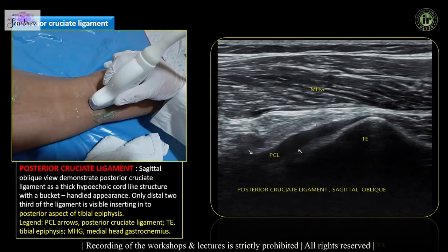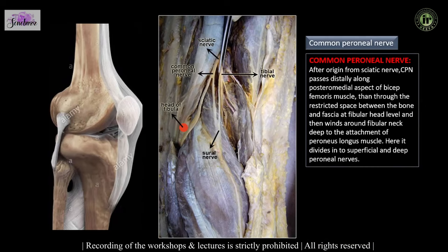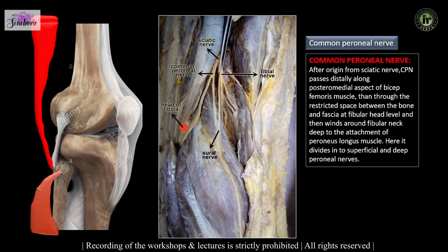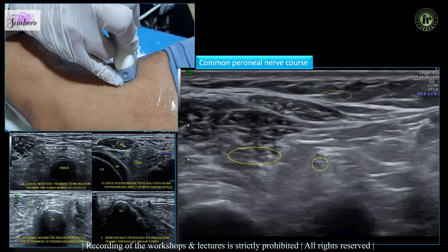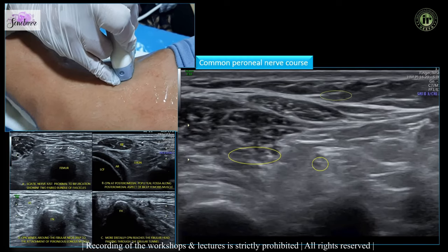Keeping the caudal aspect of the probe over the tibial epiphysis, we rotate the cranial end of the probe towards the medial epicondyle in a sagittal oblique position. Then you can see the distal two-thirds of the posterior cruciate ligament, which appears as a thick hypechoic cord-like structure with a bucket-handle appearance. Another common structure we are asked to see is the common peroneal nerve on the posterolateral aspect of the knee joint, and we can demonstrate it nicely with a little practice.